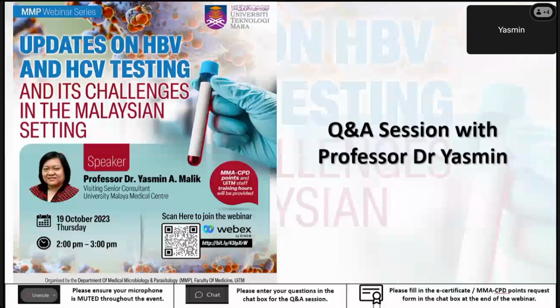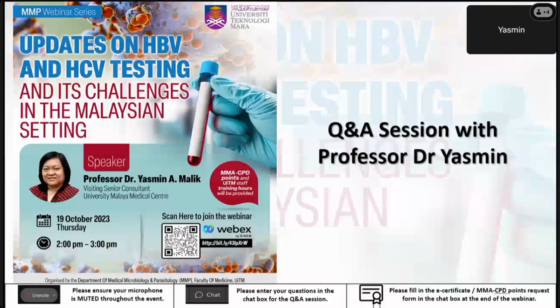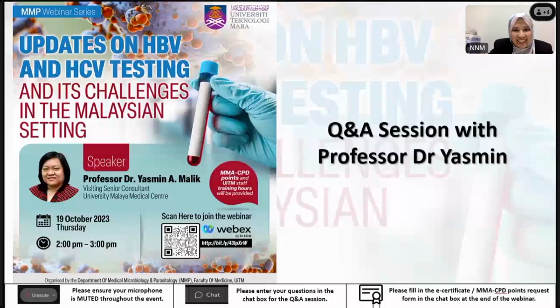And the most important thing is that with the test kits we have nowadays, there are problems of false positivity, not because of the kit itself, but because it detects such low levels that you're able to pick it up. So they need follow-up. Then you can see the full picture after that. Yes, I had that issue way back in the 1990s. Okay, Prof. Thank you.